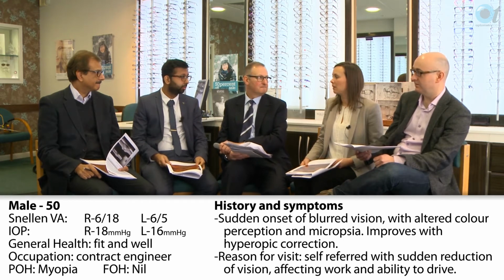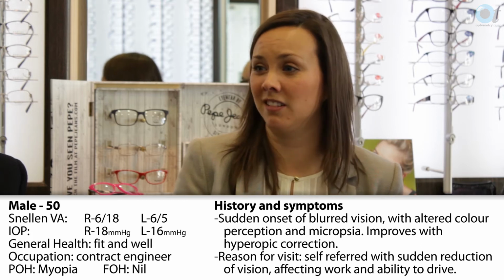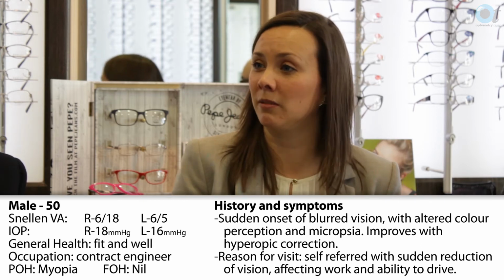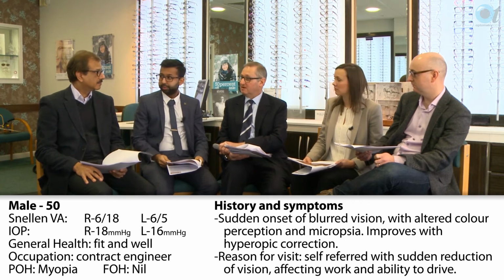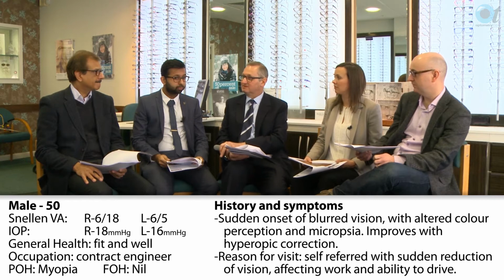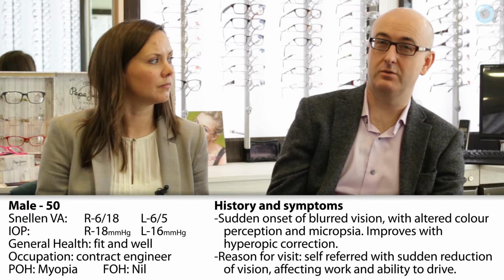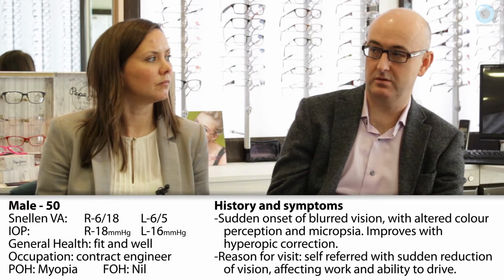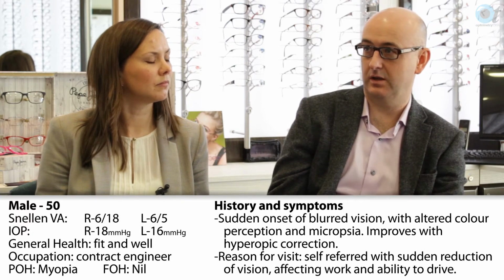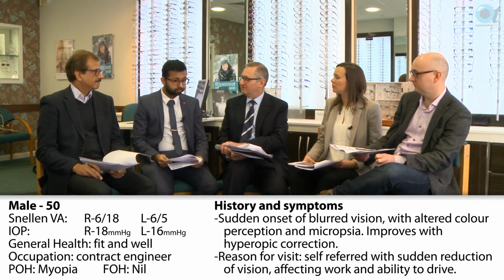Yeah, so without the OCT, I wouldn't be able to tell. I think the useful thing is if you can send the OCT images, then the person on the other end can at least triage it slightly more effectively, maybe. Yeah, that could be a really good idea. Would anybody think of just calling their local ophthalmologist and discussing it? So that's one option. It's not something that I've ever done. I'm not sure how successful that would be to pin down the right person, busy people, and get that opinion. I guess that depends on your relationship with the local ophthalmologist. So the consensus is probably refer through the GP. In this area.